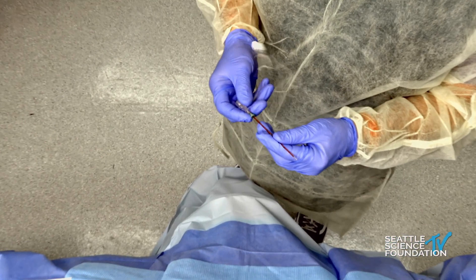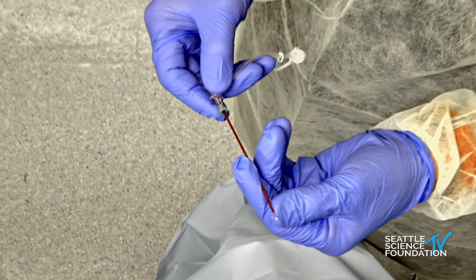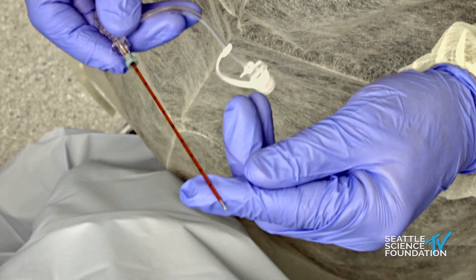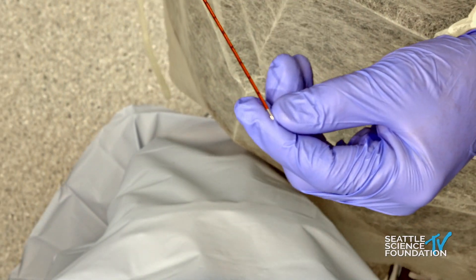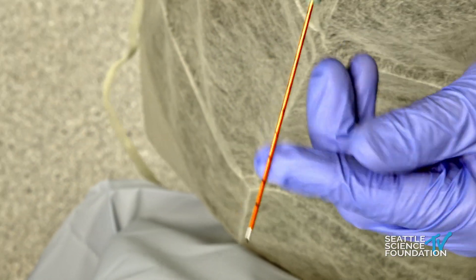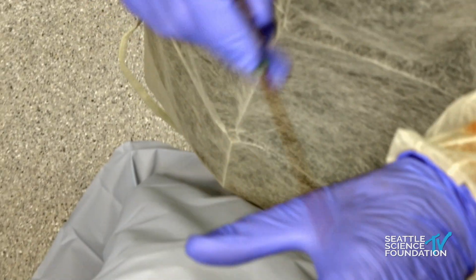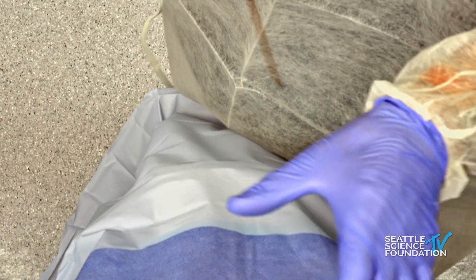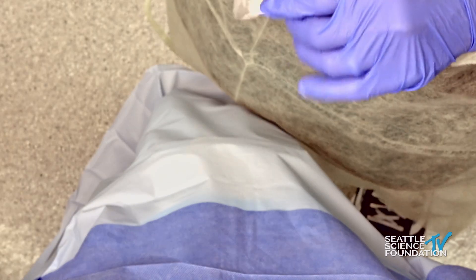This is a radiofrequency ablation tool. What I like about this is that you'll see there's a little silver end down here. Most standard RF goes from a distal tip and comes more proximal with the lesion. What I like about this one is that it comes in a diamond shape. Basically you put this down at any angle — it's called angle independence — and you can come down and get to the space. You always want to be right where the transverse process and the superior articular process coalesce with each other, but you can come in at any angle, which is nice when you have complex anatomy or if you want to just place this quickly.